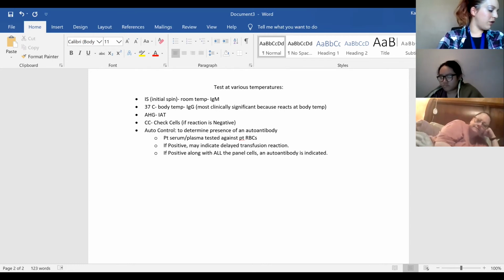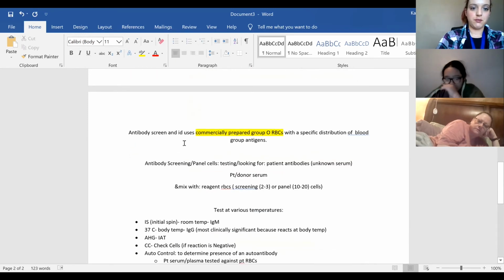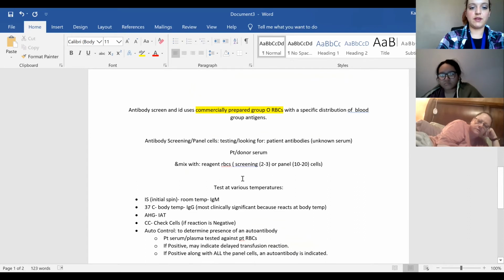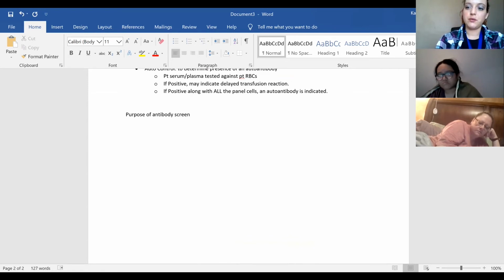Okay. So antibodies, the purpose of antibody screens. So this is more the testing of it, the process. And y'all understand when I'm referring to a screen, the screen and the panel are pretty much the same in regards to information. Generally they're the same. When I talk about an antibody screen, that can be following the antibody panel too, unless I'm specifically separating them.